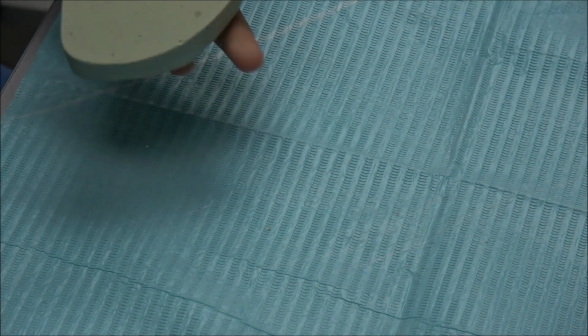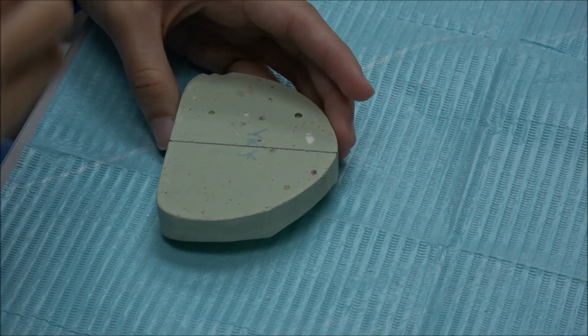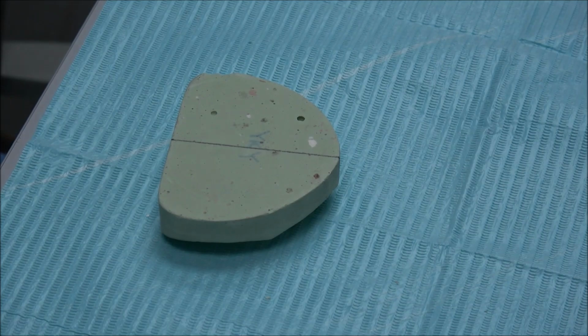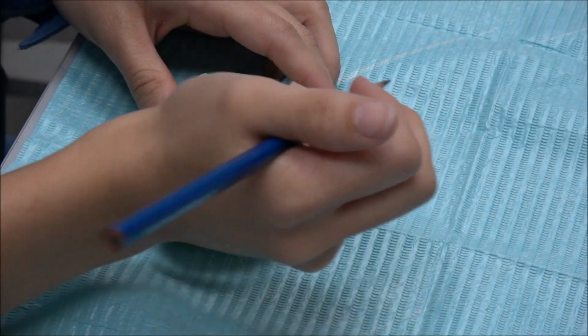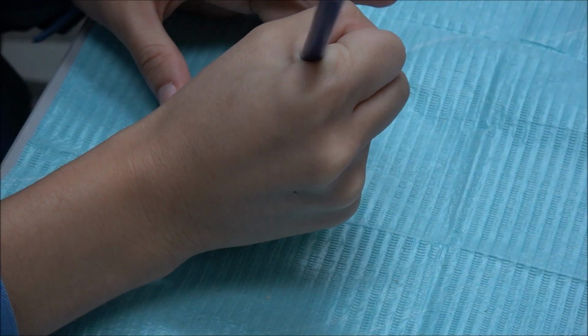So before we trim, if you're not sure, you can draw the V shape to prevent over-trimming. And then the depth of the V shape is 6 millimeters. So we draw the V shape first. Side here, we draw a V shape.